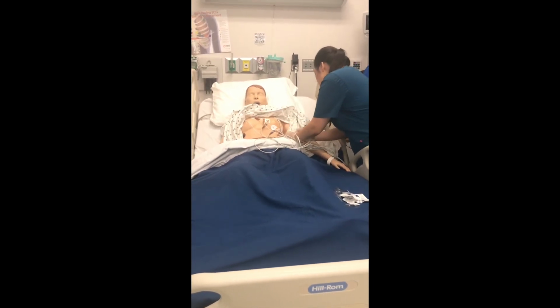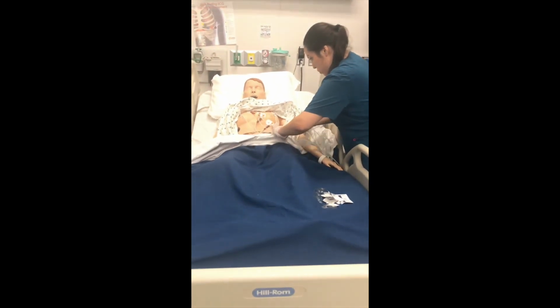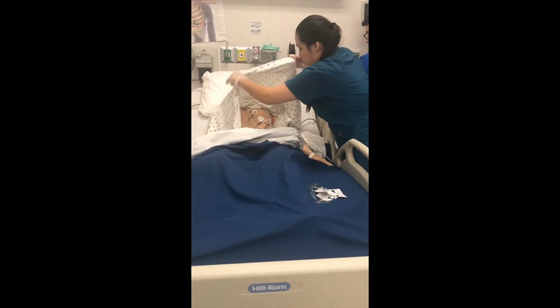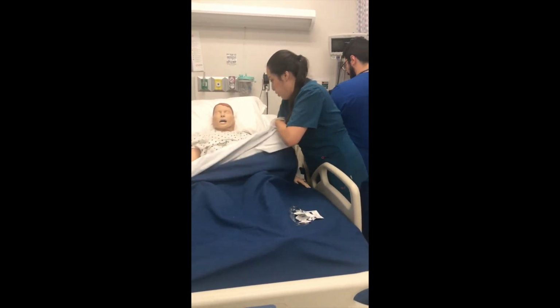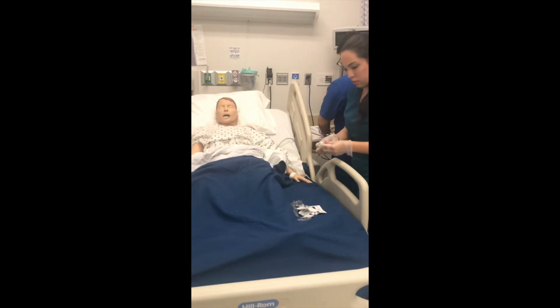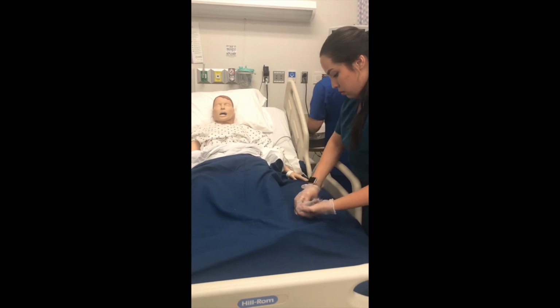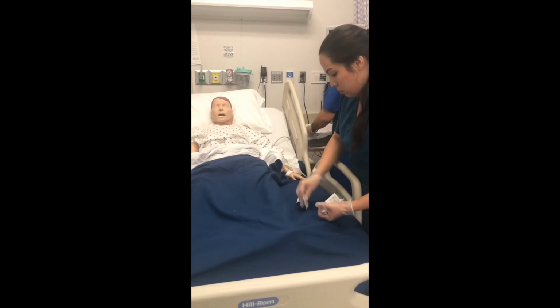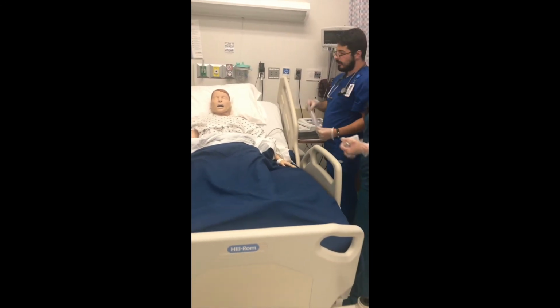Once electrodes and leads are attached, ask patient to lie still for recording of ECG according to manufacturer's directions on the machine. I'm just gonna have you lay down here for a little bit still, okay? Try not to move, buddy. Okay, EKG is all done. We'll be removing the electrodes now, okay?